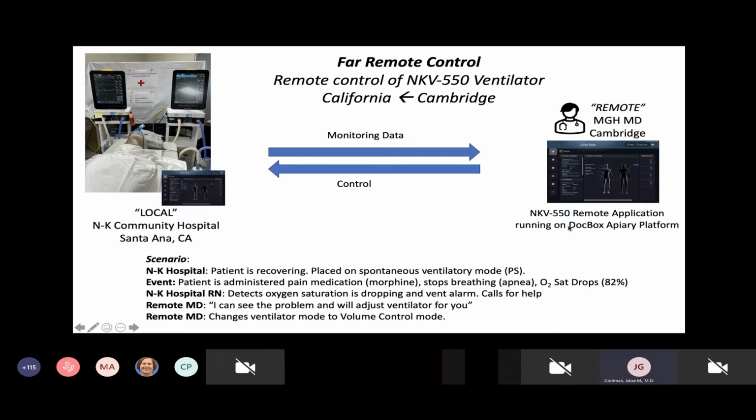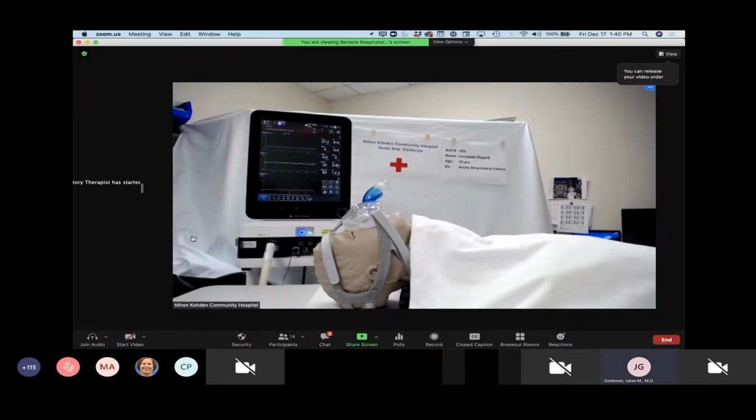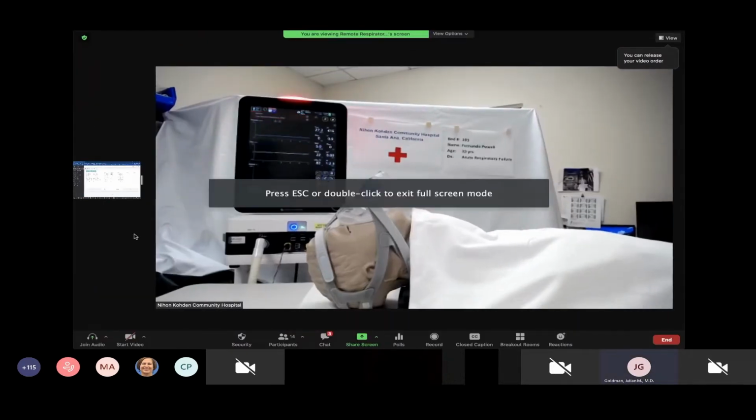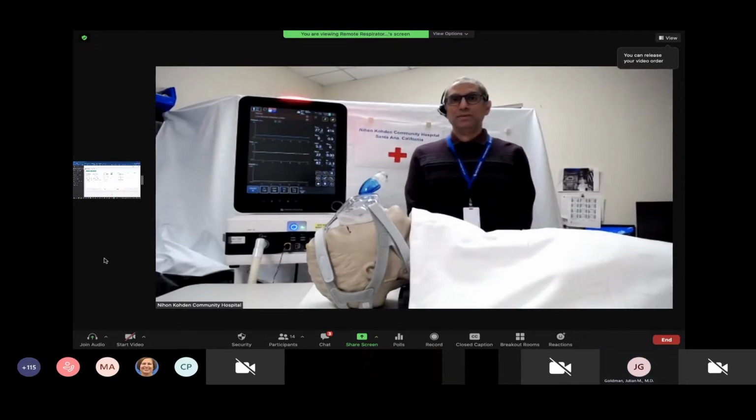And by the way, we'll all be playing different roles without actually changing hats, so hopefully it'll be easy to follow along. All right, with that, we're going to switch to the NK hospital, and let's get started. Let's start the simulation.